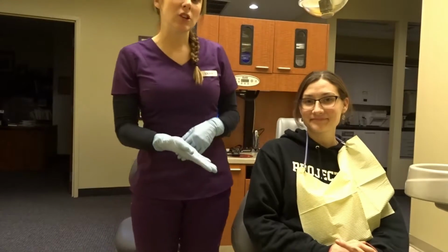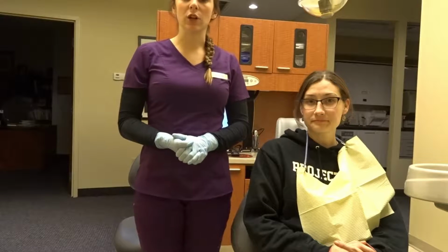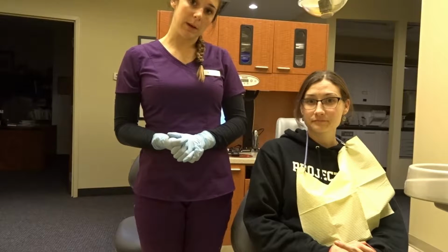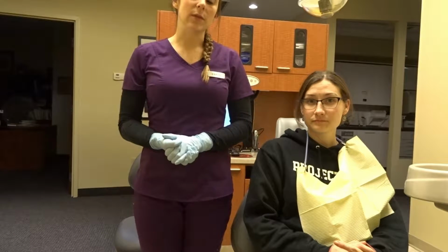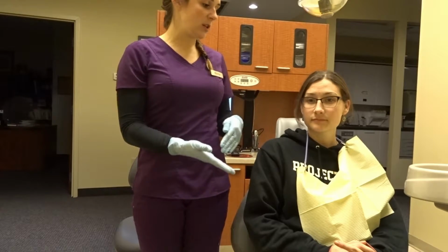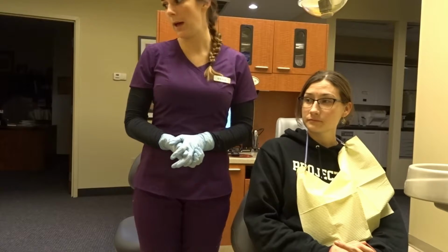Okay, so here we have our patient who I will be demonstrating the Oral DNA test on. This patient suffers from periodontal disease, and that was determined through full mouth probing and pocket depths above 4 millimeter pockets in all 4 quadrants. There was more than 30% of bleeding on probing and signs of inflammation. I initiated this test because it is important for us as clinicians and the patient to be aware of the possible effects of this bacteria affecting her systemic health as well.